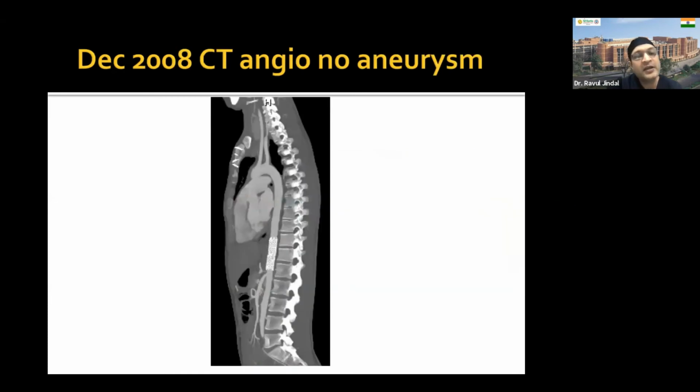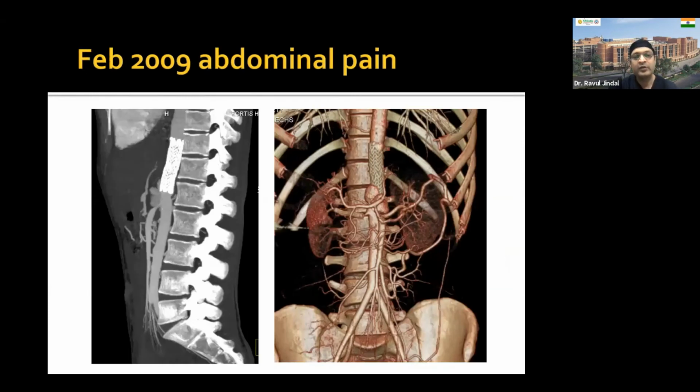And then we took an angiogram after 1 year, and we found, as you can see, no aneurysms in the aorta, carotids. The subclavian has sealed up, the celiac artery was doing well, the right iliac aneurysms were healed up, and the renal artery was sorted. So we were very happy with this patient.